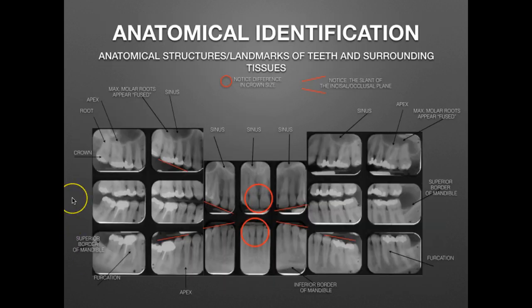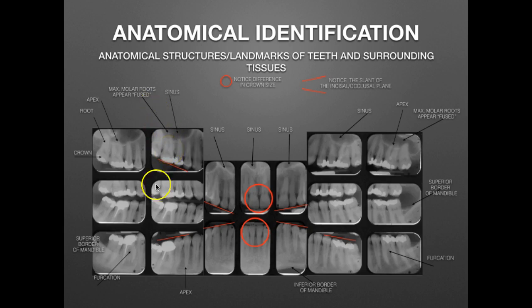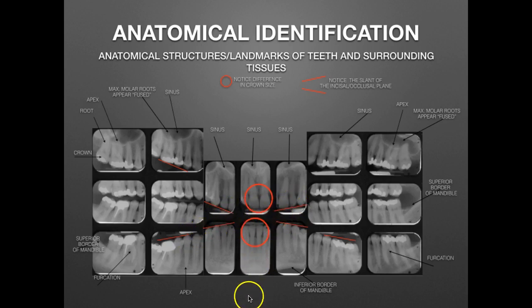Here is a repeat of the anatomical structures and landmarks of the teeth and surrounding tissue. You can see the apex, the furcation — trifurcation or bifurcation — and also the slants of the occlusal and incisal plane. These can all help you in mounting the radiographs correctly.